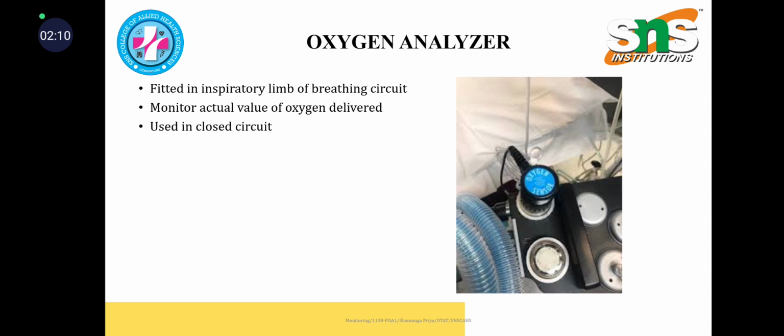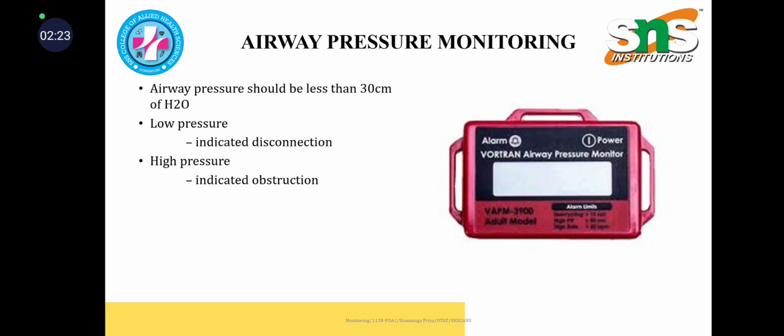Next, here comes the oxygen analyzer. It is fitted in the inspiratory limb of the breathing circuit. It monitors the actual value of oxygen delivered. It is used in closed circuit.